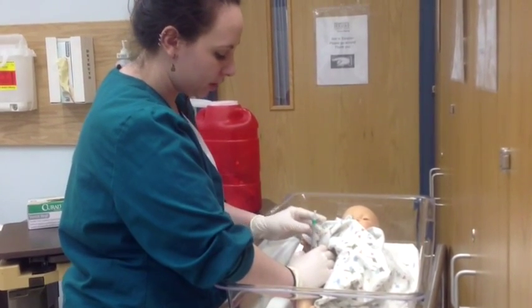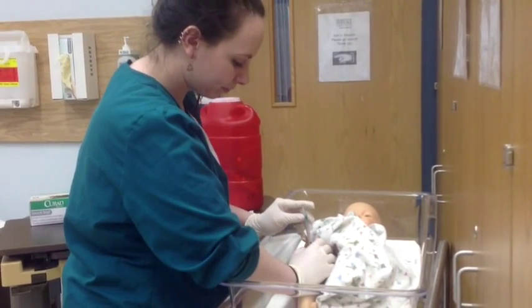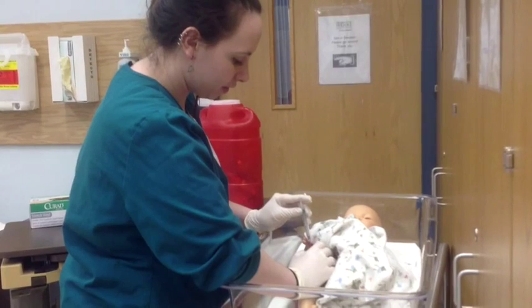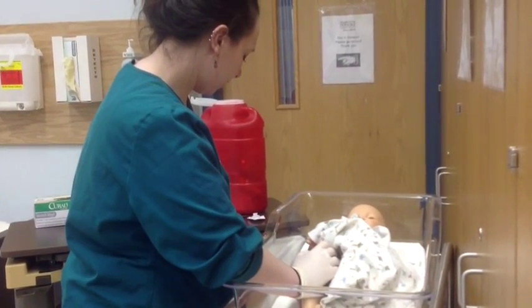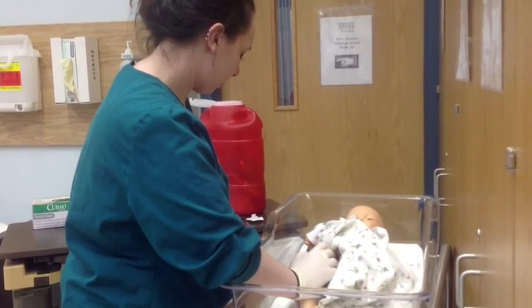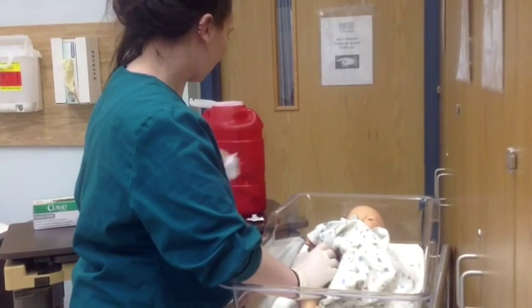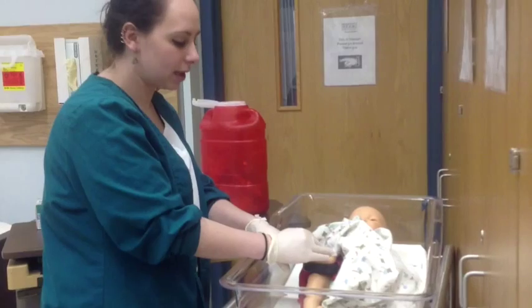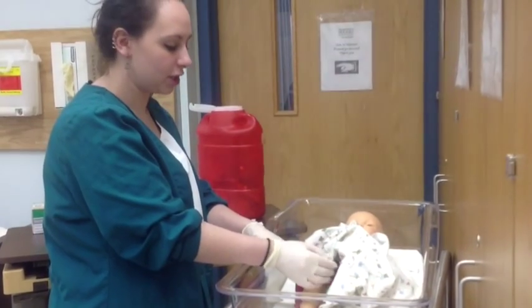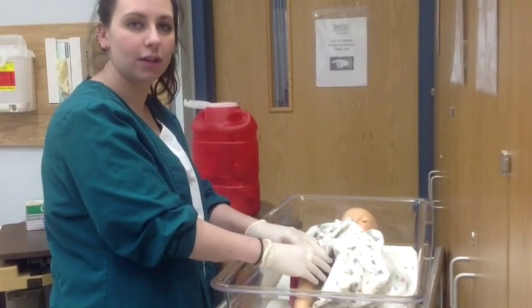So once it's down, you're going to pull the needle up and out. And when you do so, you're going to turn the needle away from everyone. And you close the safety. Make sure it clicks on lock so you're putting it in a sharps bin. You're going to apply pressure to the injection site, but you're not going to massage it. It causes more problems in the long run.